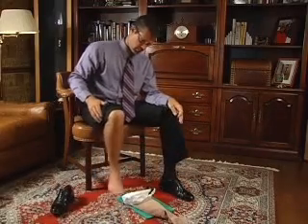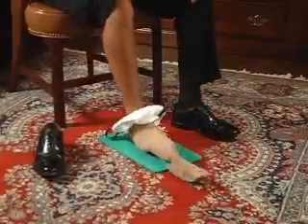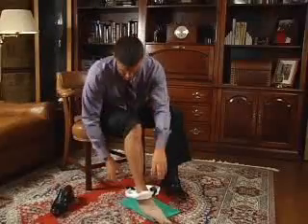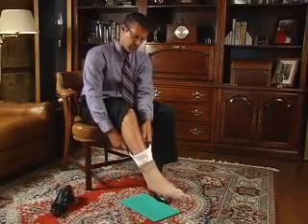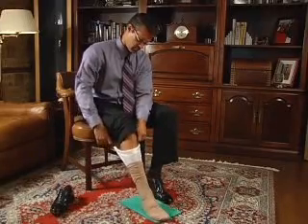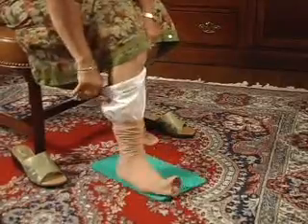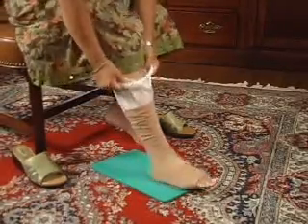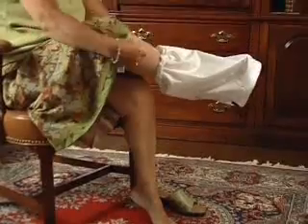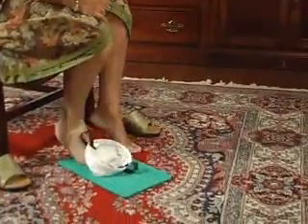Here is another method for hands-free application of a compression stocking. A combination of foot rocking and pulling the stocking applicator greatly facilitates application of the hose. This applicator can be used for both closed and open-toe stockings. Removal of the hose can also be accomplished using the applicator and the hands-free technique as seen here.